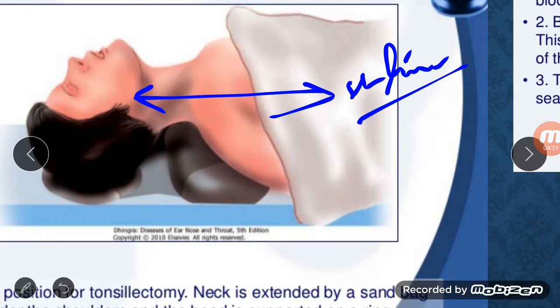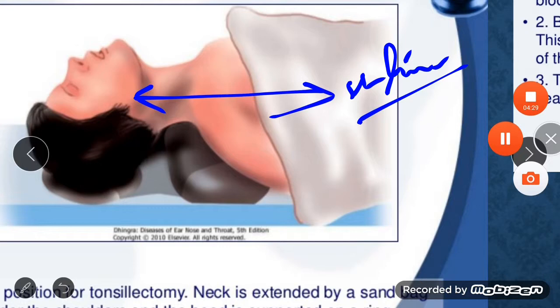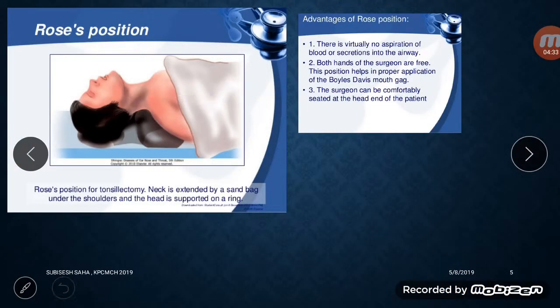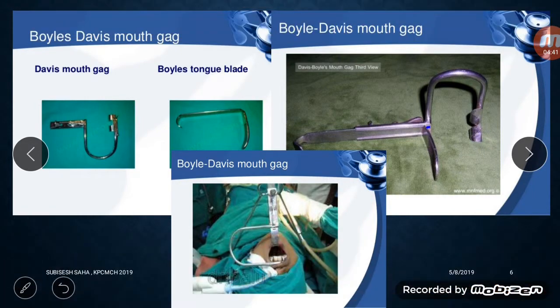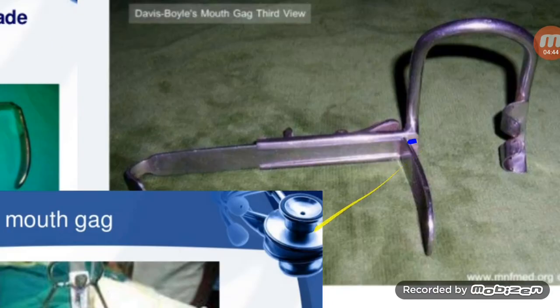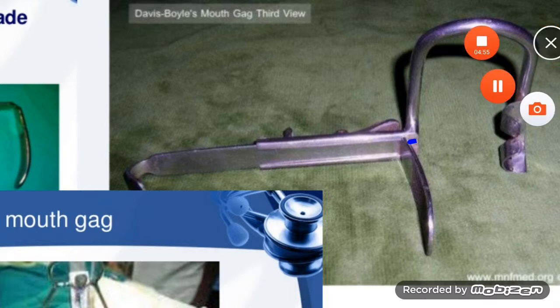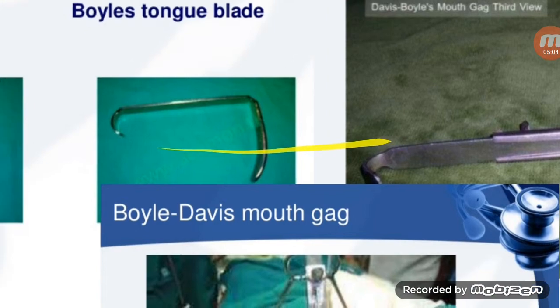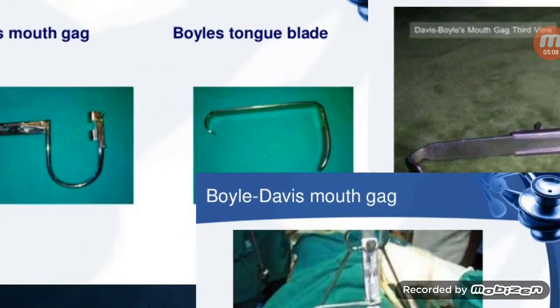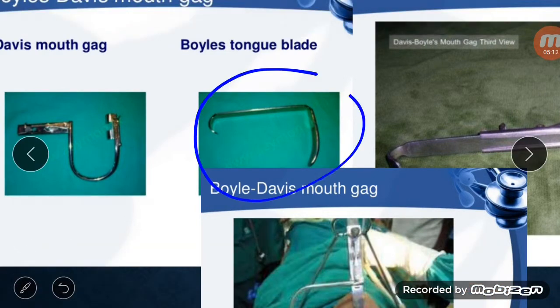Coming to the Boyle-Davis mouth gag: this is a complete set where the gag is already attached to the tongue blades. The Boyle-Davis mouth gag consists of two parts. The first part is the Boyle's tongue blade, and the second is the Davis mouth gag.